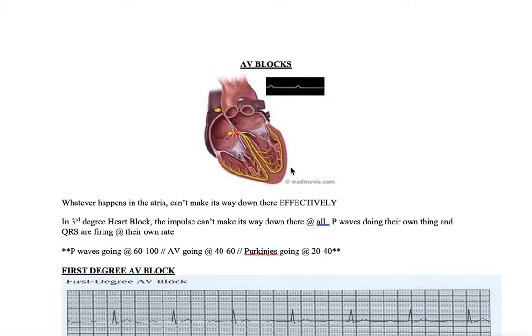Today we have another video and we are going to talk about AV blocks, commonly known as heart blocks. So if you're following along with the study guide, which I highly recommend that you do, we're just starting here towards the middle of the study guide. You'll see it. Again, this is what it looks like. This is the page to start on.